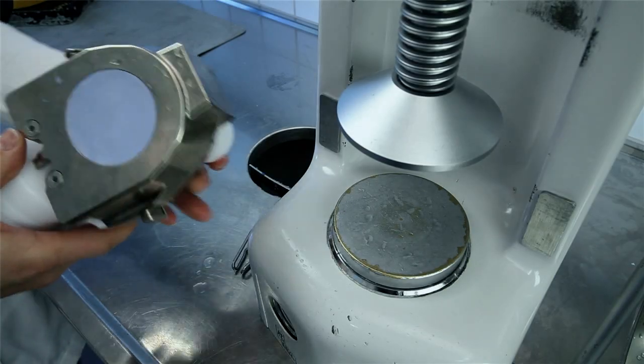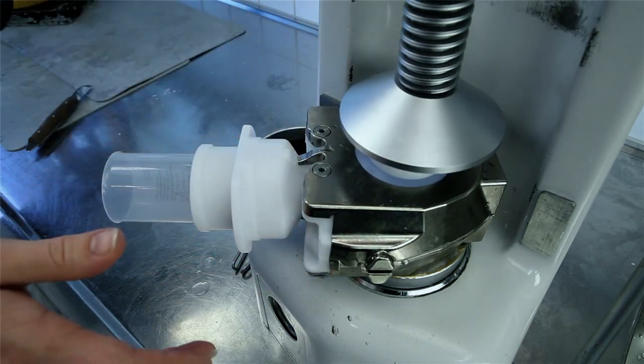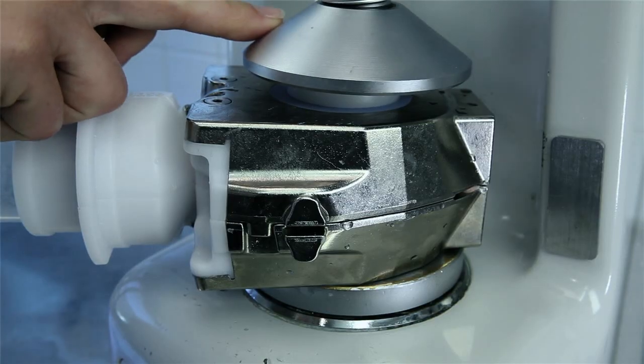Place the flask under a dental press with the divesting aid positioned between the stone and the press table. Load the divesting aid with slight pressure.